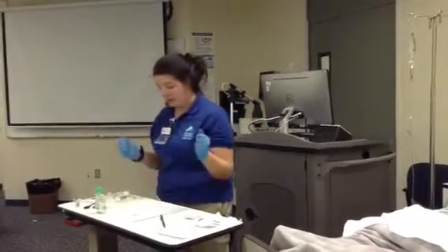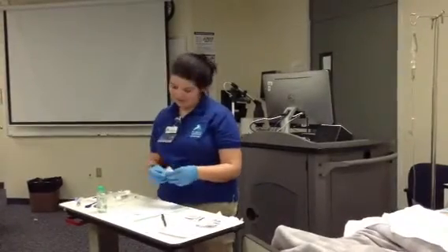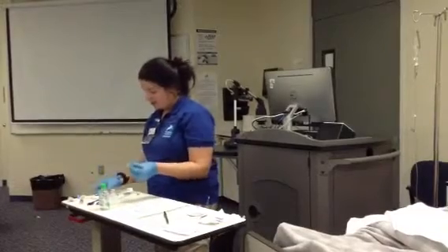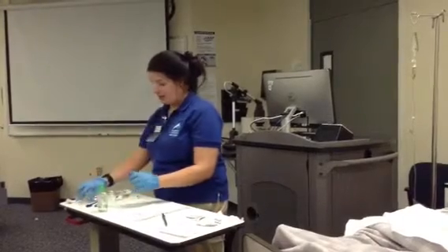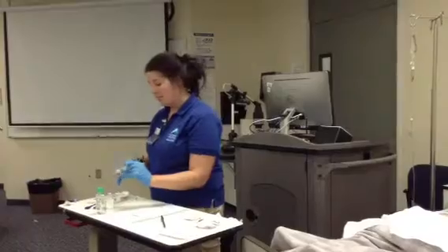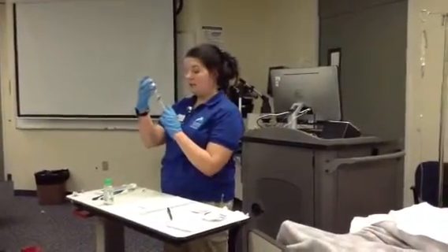Okay, so first thing, I'm going to clean the tops with alcohol. I would go in the trash, clean this, and clean this. Alrighty. Go ahead and get my 1 milliliter, double check my dosage cup once again, 1 milliliter, inject it with air, back, pull up 1 milliliter.